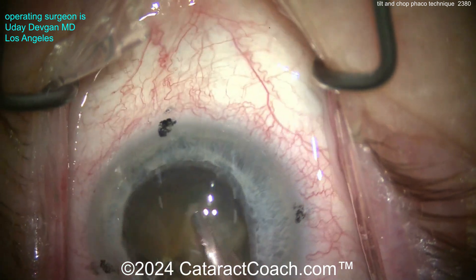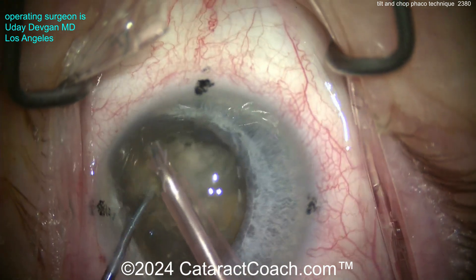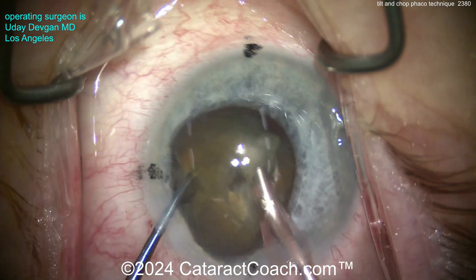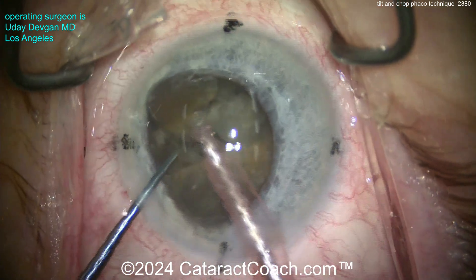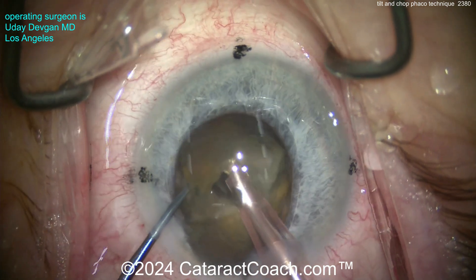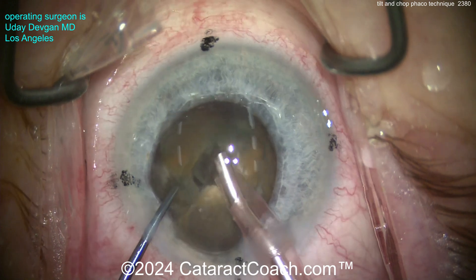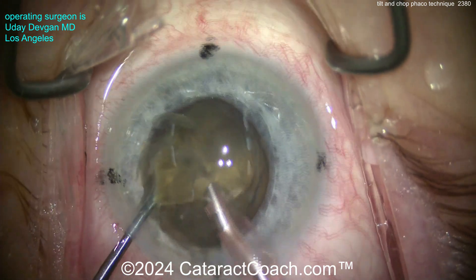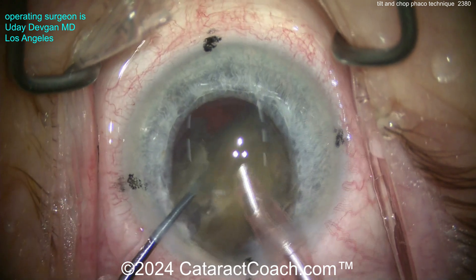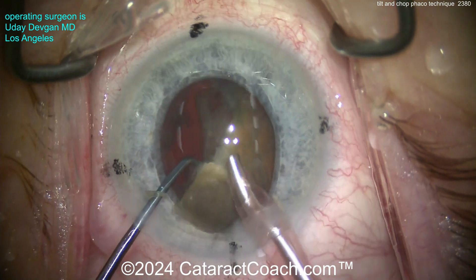You can now get the first half and chop it even a little bit more, then aspirate these pieces out. We're using phaco power modulations — burst mode or pulse mode. We're using a variable duty cycle in pulse mode: at most 50 on / 50 off, or maybe 60 off and 40 on, to minimize the total amount of energy delivered.